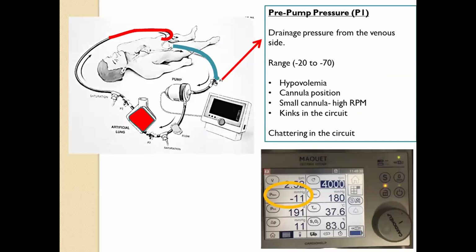Other thing, we look at pressures. There are 4 important pressures that we monitor.